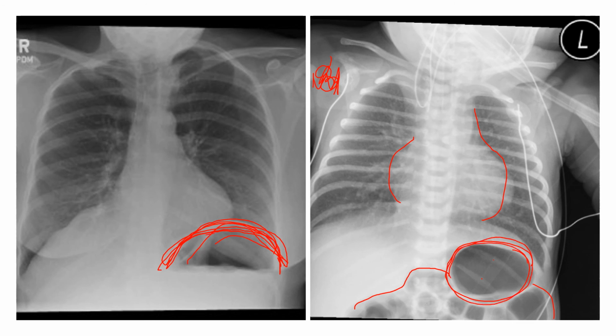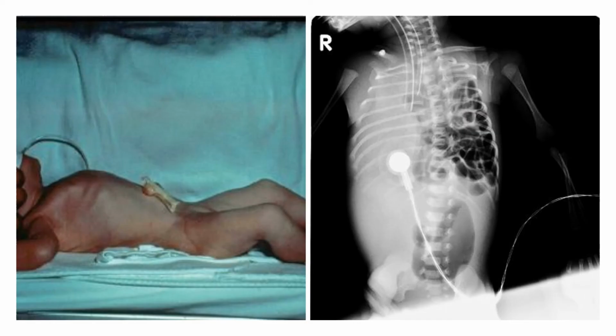Now adults, we do have that problem as well, especially if, let's say, we've been using an ambu bag and mask and we're doing CPR and we haven't intubated the patient. So we're bagging the patient and let's say some of that gas is going to their lungs, yes, but is it possible some of that gas can be going in their esophagus and heading right into their stomach? Absolutely. And that could be causing gastric distension as well. So that's something that we should be aware of. So that's something in kids, right? That's something that I look at too.